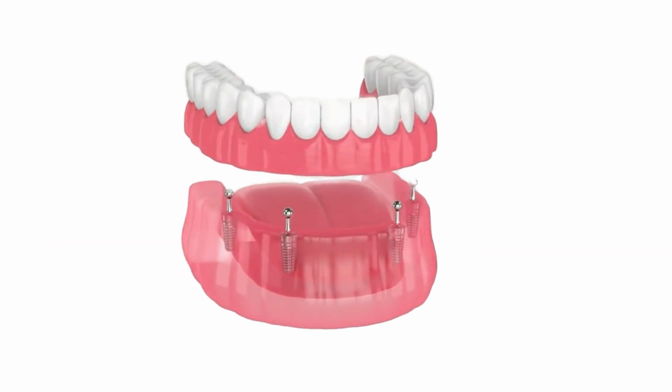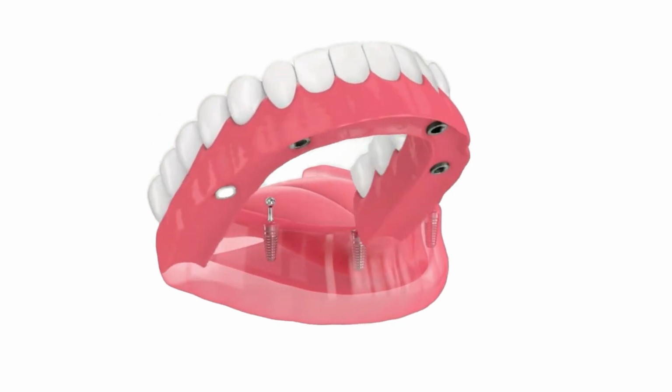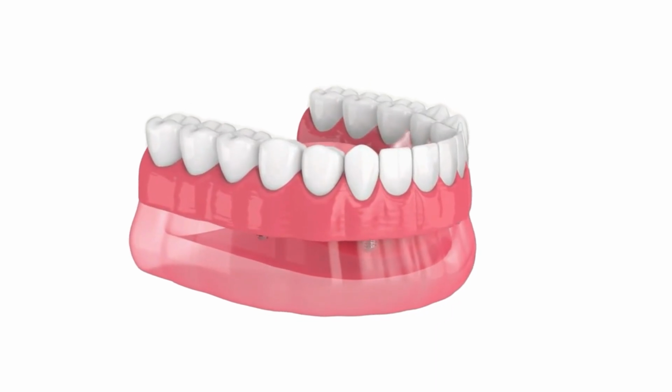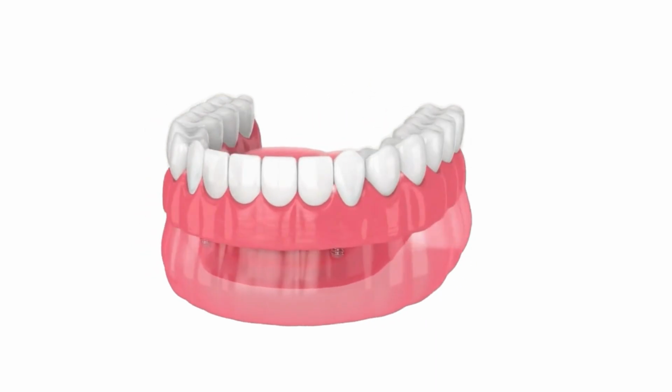On the other hand, we have overdenture cases, which is a detachable prosthesis that goes on either 2 or 4 implants. This type of process is very, very nice. It's much better for the patients than just a regular denture.